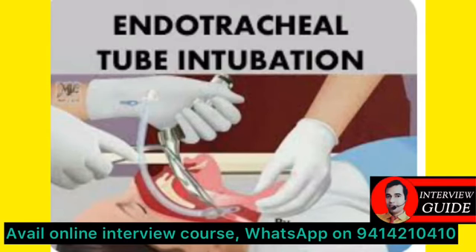We should prevent any type of injury in the mouth. When putting the blade inside the mouth, we insert from the right side and push the tongue toward the left side. Further, we advance the blade until it reaches between the tongue and the epiglottis.